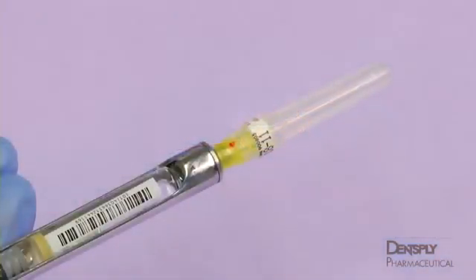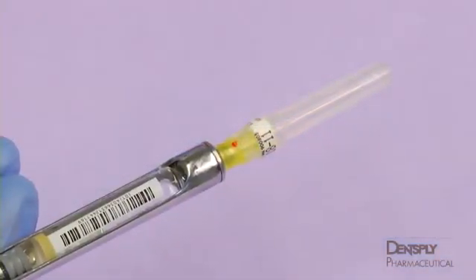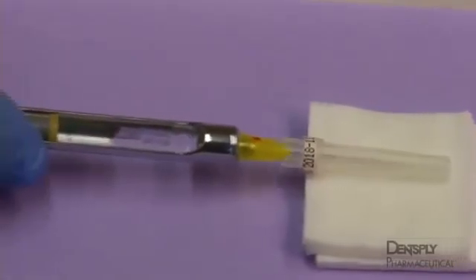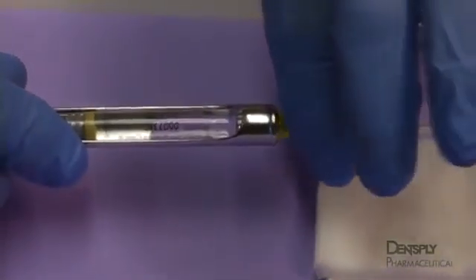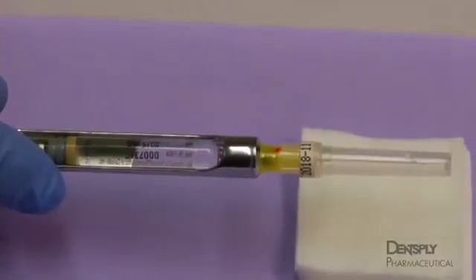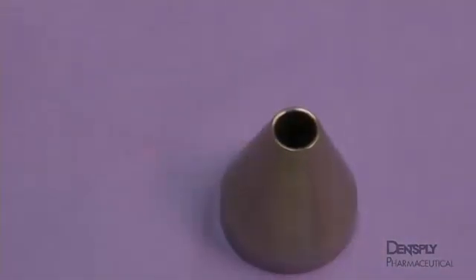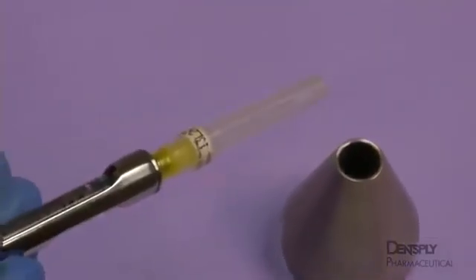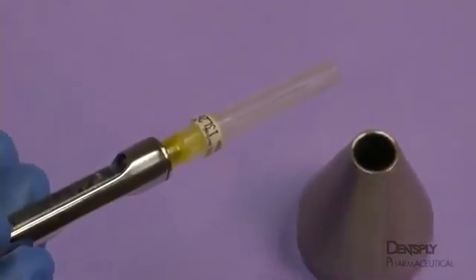Proper care and handling of contaminated needles and cartridges will reduce the risk of sharps exposure to the patient and clinician. Needles should be immediately covered by a protective shield using a one-handed scoop method after use to prevent accidental needle stick with the contaminated needle. Besides using the needle cap, several recapping devices are available to assist with this recapping. Recapping devices come in cardboard, metal, and plastic materials.